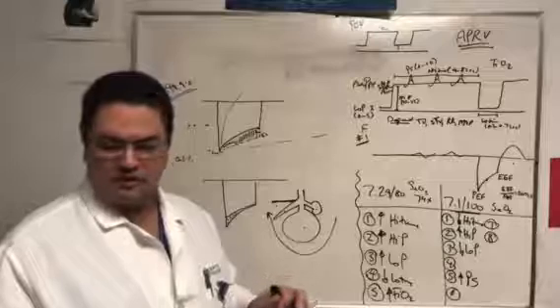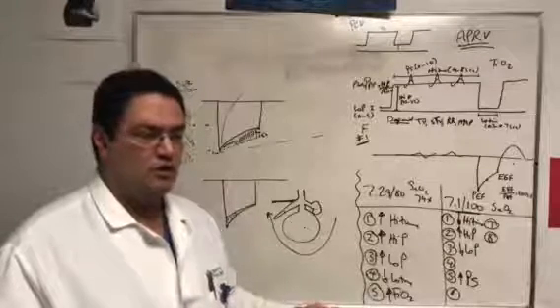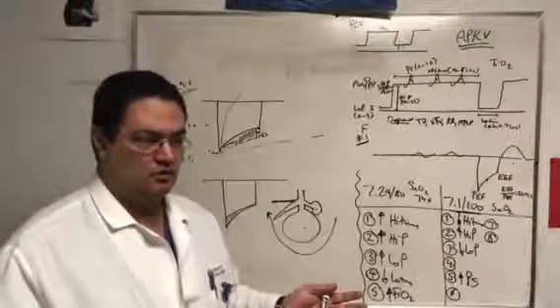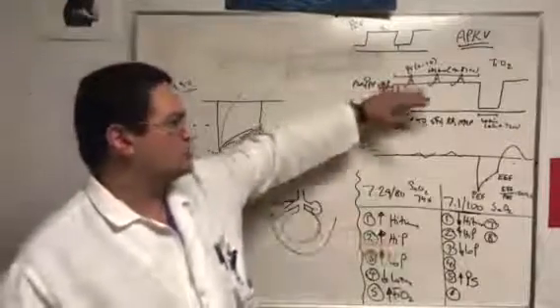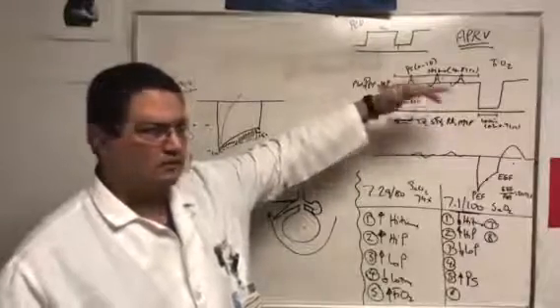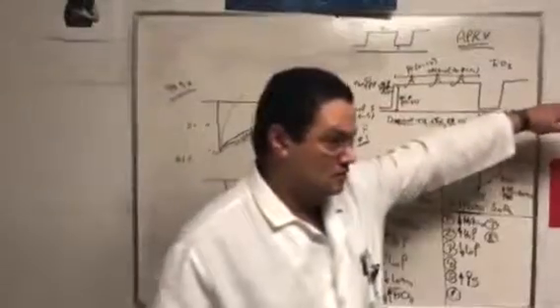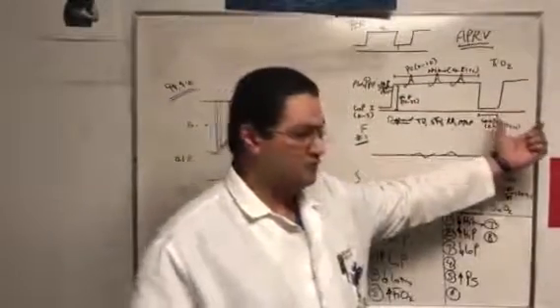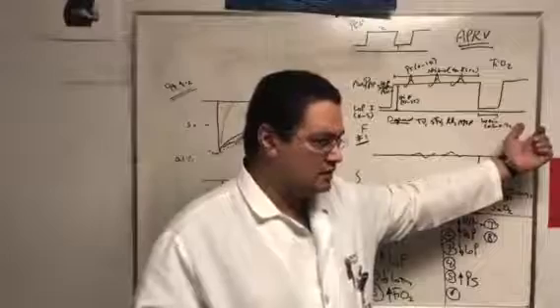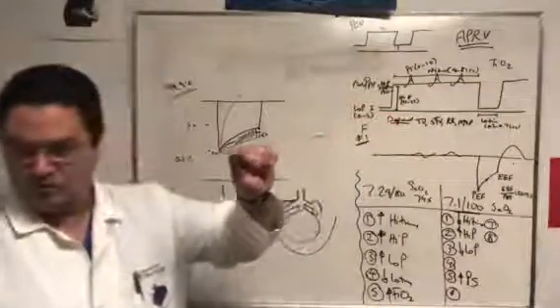There are only a few circumstances where we should increase the pressure support, which is when we wean the patient. Let's say the patient is weaning, and the high pressure is going so low now, like 10, 15, let's say 15, for 14 seconds, right? And 5 pressure for 0.5 seconds. So what's the difference between 15 and 5? That's a very, very small delta, so very small tidal volume.